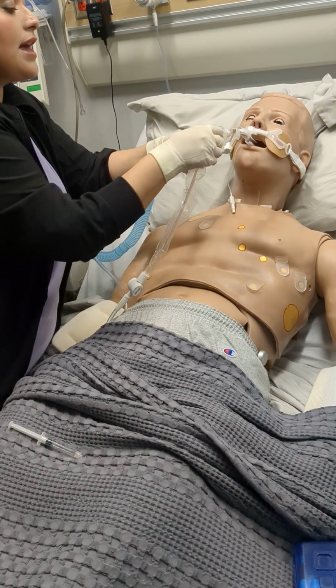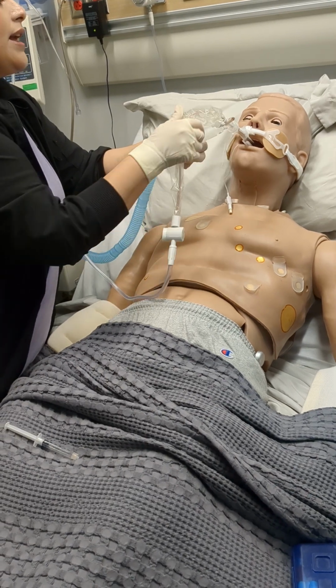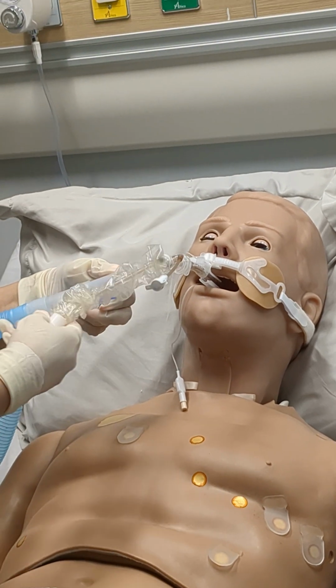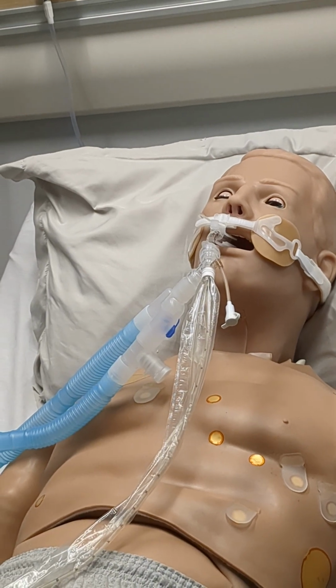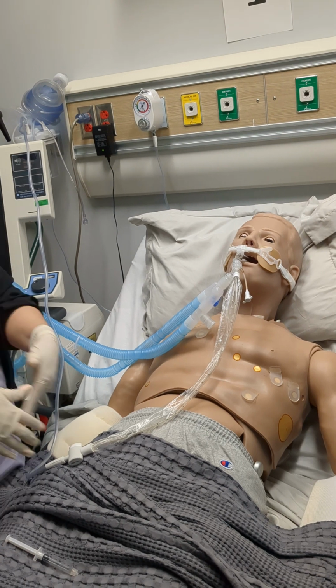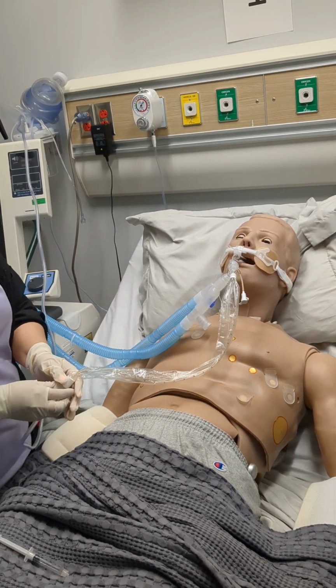That way, when I go down, I'm gonna be able to bring out more secretions, but sometimes the patients don't tolerate that. Won't they choke? And you're washing out the bacteria from the upper airways that you already brought up, so you push it back down to the lower airways. So that causes pneumonia and all that? Exactly.